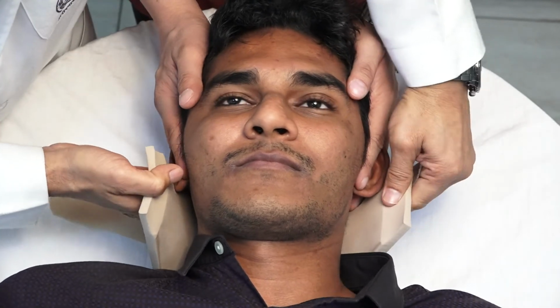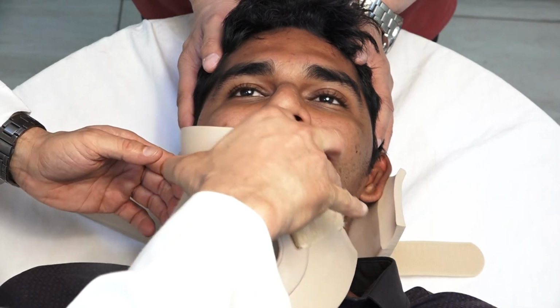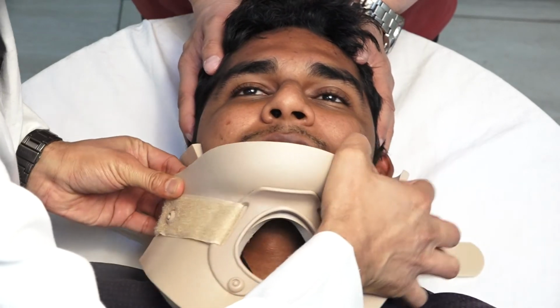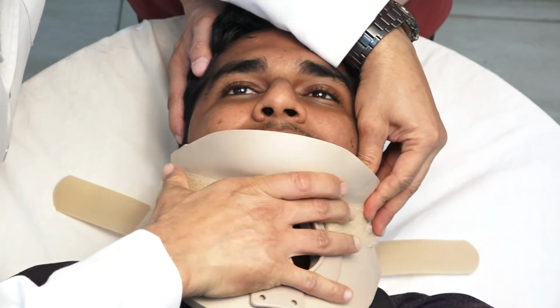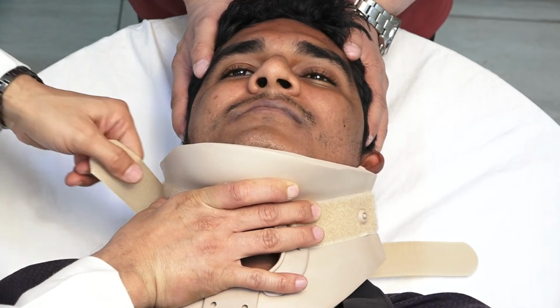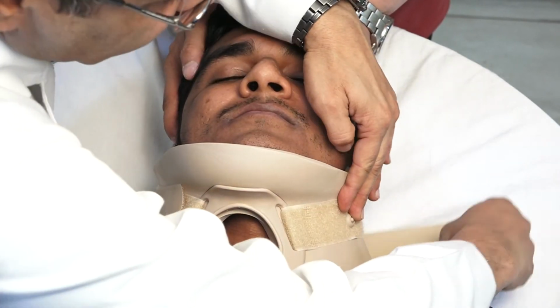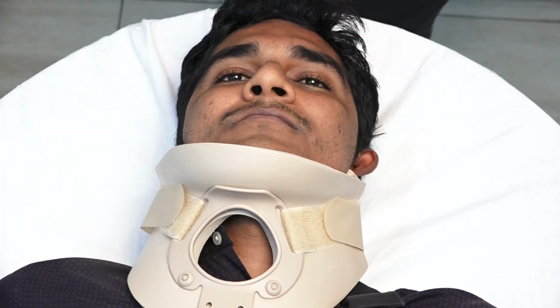Like this. You have to just hold it here, Dr. Ankit. And once this is in place, I will take the anterior component of it. I will fix it through the upper part here, and then we'll fix it with the Velcro tapes on either side. Now you can leave, and the spine is immobilized.